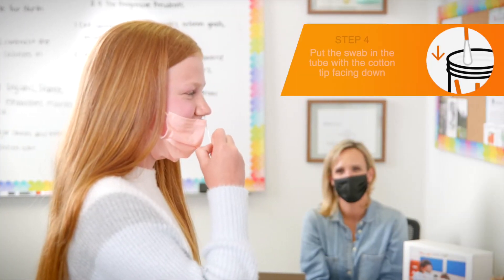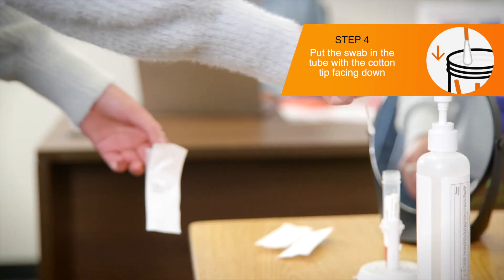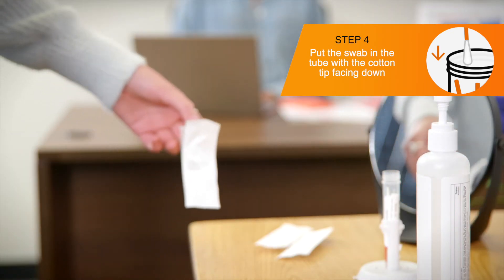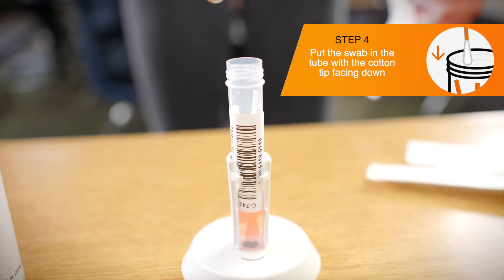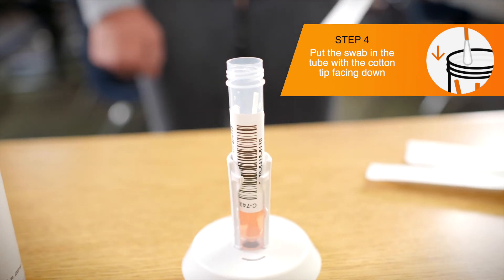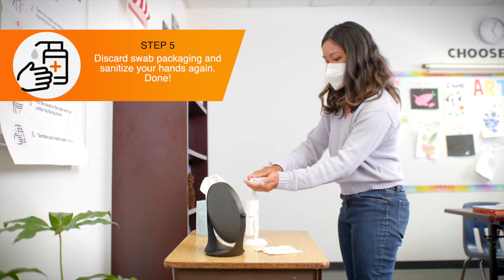Once participants have collected their samples, they can put the swab in the open tube in the tube holder, cotton tip facing down. There may be other swabs in the tube, so be careful not to tip the tube over. Discard the packaging in the waste bin.